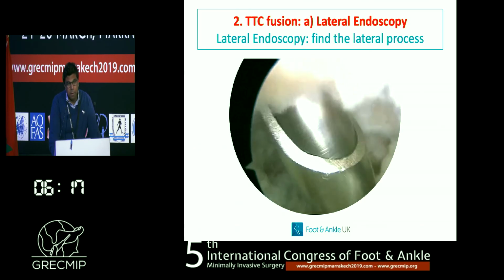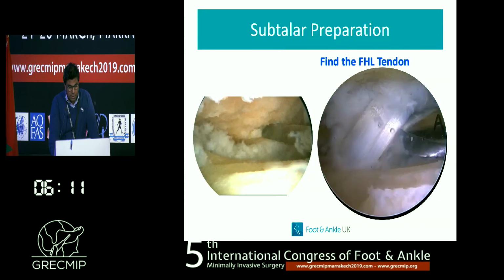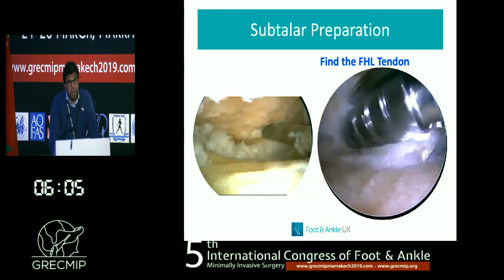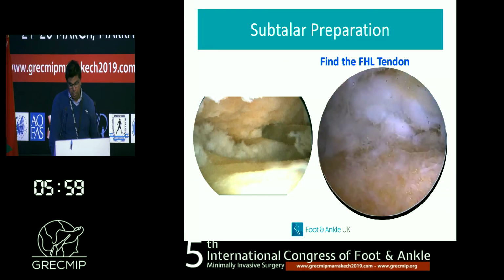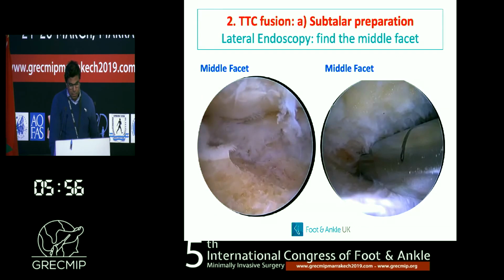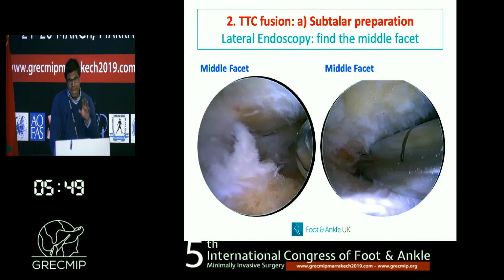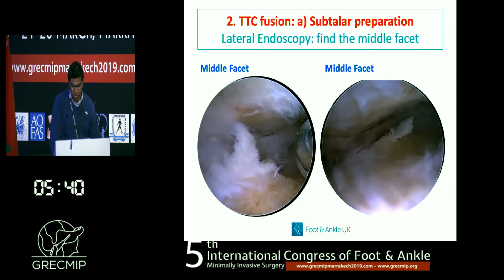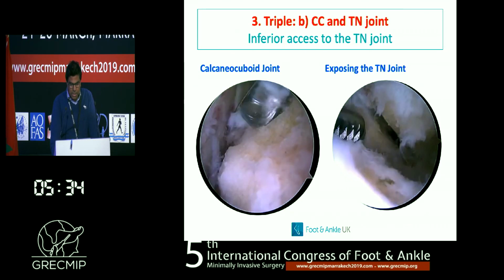So the first step is to identify the lateral process. Once that's done, you can then follow with the shaver right back along the posterior facet, and then sharp shaving across the posterior facet. Once you identify the FHL tendon, you can ensure that you remove adequate bone from the medial side. The temptation with open surgery is to do all your work on the lateral side and not do enough on the medial side. From the FHL tendon, you can then identify the middle facet. This is hidden between dense interosseous talocalcaneal ligament, which needs to be removed. Once you shave through there, and you can see it right deep in the depths of the scope portal there, that's the middle facet. And from there you can follow it into the anterior facet.